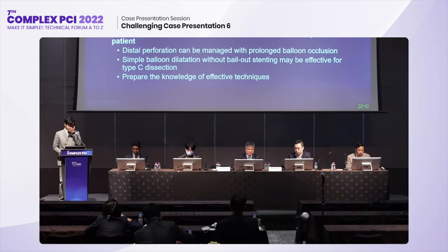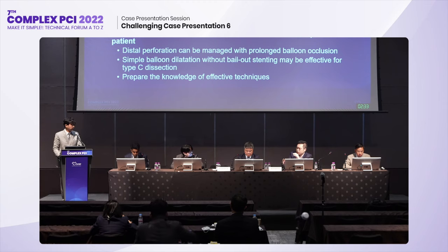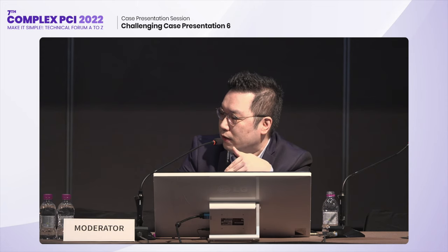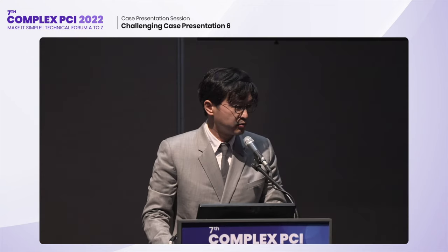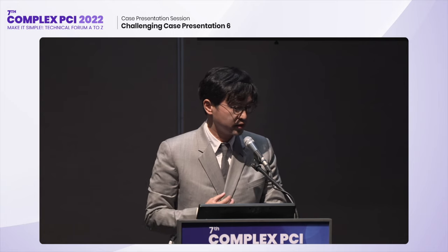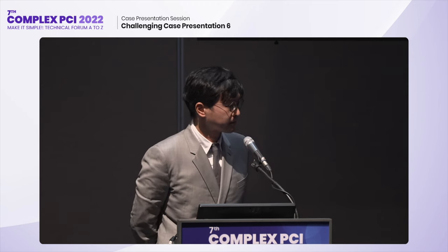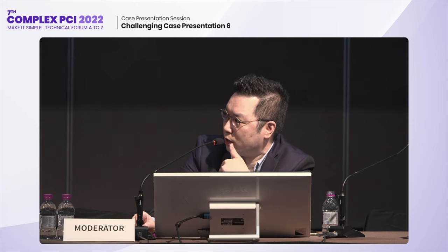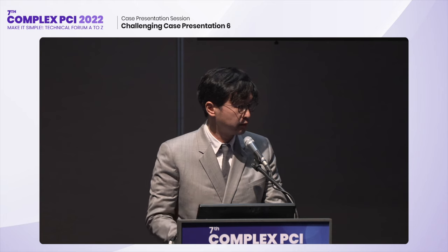Okay, thank you, Dr. Chen, for the interesting case showing two complications at the same time. May I ask, did you do any IVUS check when you rewired the branch of the OM, to see the mechanism of the dissection or how extensive the hematoma is? I didn't perform IVUS at that time because the operator was confident of his skill. And may I clarify, after the TIMI 3 flow resumed, did the operators terminate the case, or did they do some balloon dilatation or any intervention to that branch? No, just a small balloon to open the dissection and keep the TIMI 3 flow.